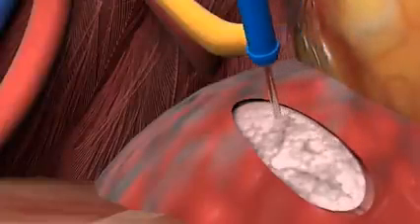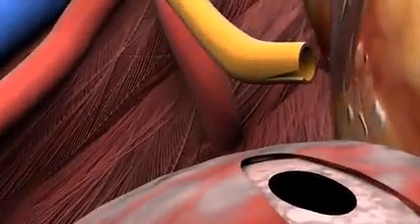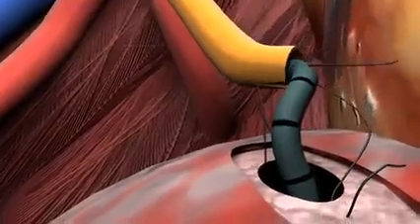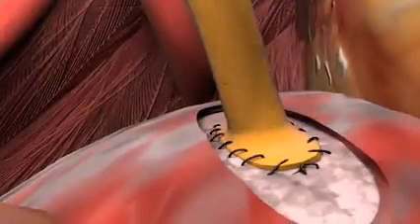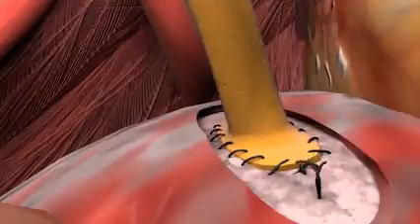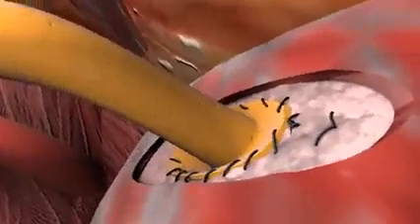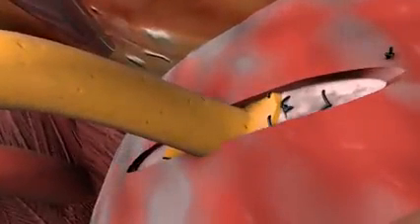The bladder is now opened, first the muscular layer and second the ceromucosal layer. Corner stitches are placed between the urinary bladder and the ureter. The ureteric stent is inserted. The ureter bladder anastomosis is now performed using semi-absorbable 5-0 running suture. The anastomosis is retracted into the bladder and the muscular layer is closed over the ureter anastomosis to create a valve effect that minimizes urinary reflux.